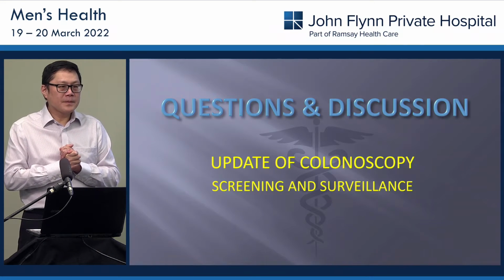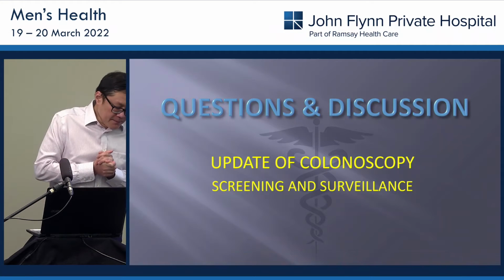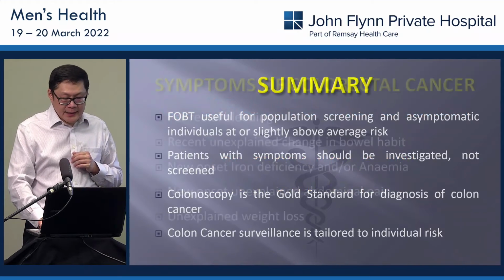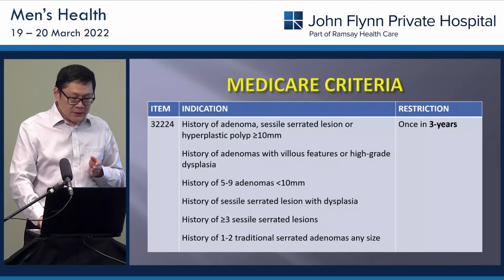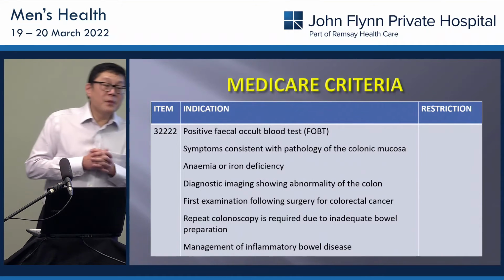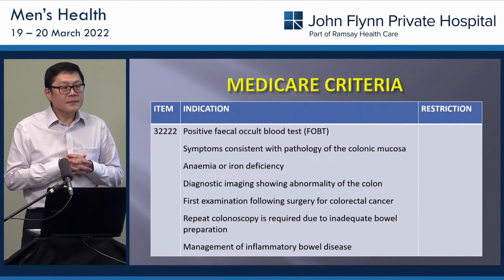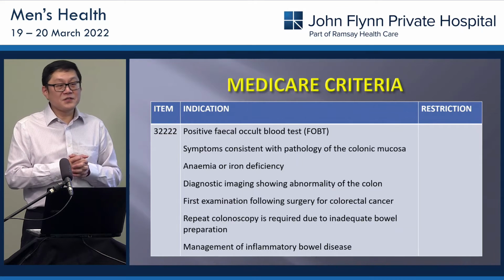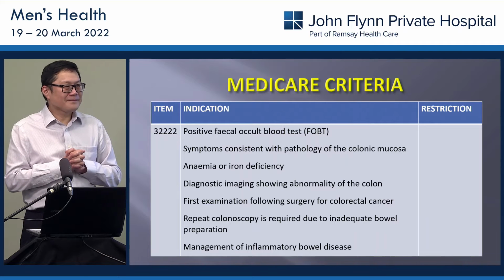Is there a notion of having an initial colonoscopy in the screening program? So there isn't. So I guess if we go back to the slide where there is. So these are the indications that we are allowed to perform initial screening colonoscopy. But if a patient has some symptoms, even if it's transient, that would be enough. Okay.